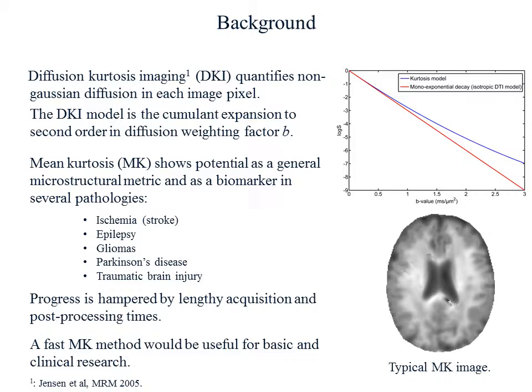Clinical application, however, is held back by the rather large data requirement for DKI and also the rather long post-processing times that are connected with DKI analysis. So a fast method for mean kurtosis estimation would be helpful for clinical application, clinical exploration, and even in basic research.